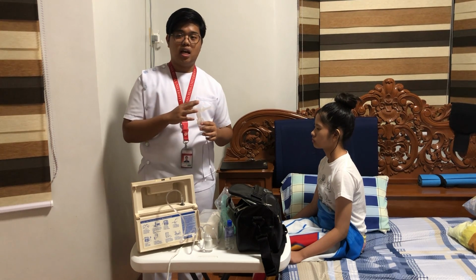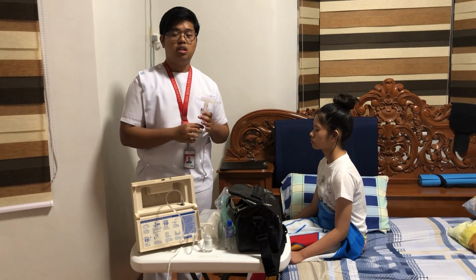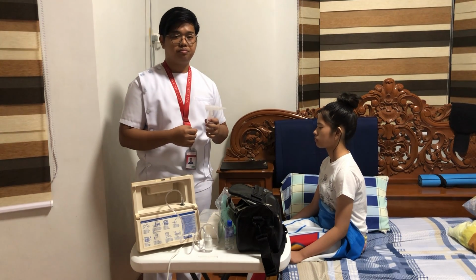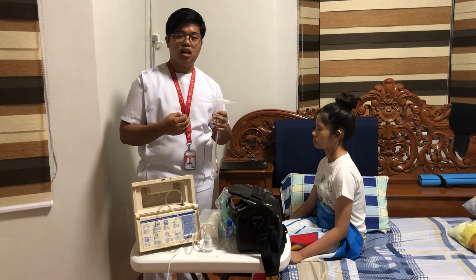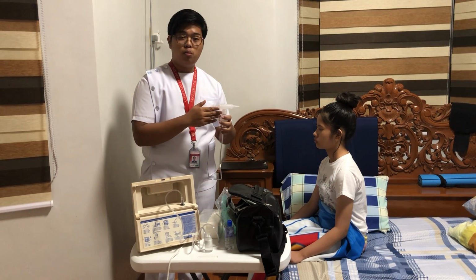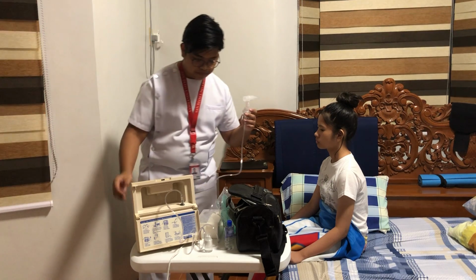the mouthpiece, the next thing that we need to do is to make sure that the flow meter is attached to the gas source. And then after doing that, we need to attach the nebulizer to the gas source and adjust the flow to 6 to 8 liters per minute, to promote the adequate functioning while preventing the excess venting. And then after that, we need to check the outflow port of the nebulizer to check if there are adequate misting. So we're going to check it.